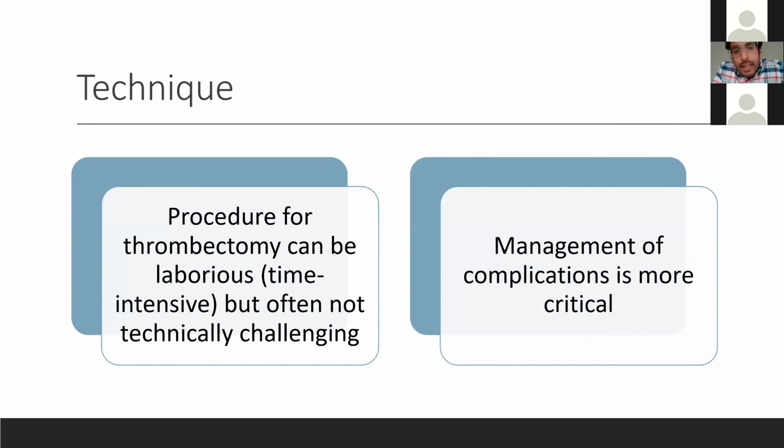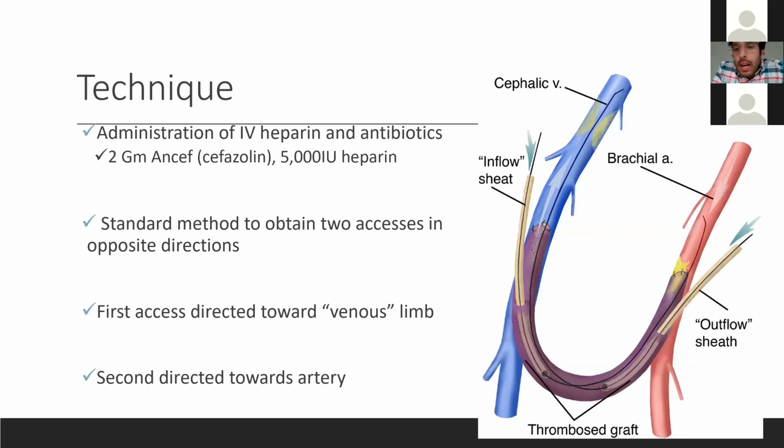As far as the technique for declotting goes, like I mentioned, the procedure honestly is not very difficult from a technique standpoint. It's just the time and energy and effort that you need to spend to get things open. And really, the only things that I think are actually difficult is the management of the complications per se. So again, this is my technique, and this is how I deal with it. Again, when we get to the questions part of this, we can discuss to see how other people are doing this.